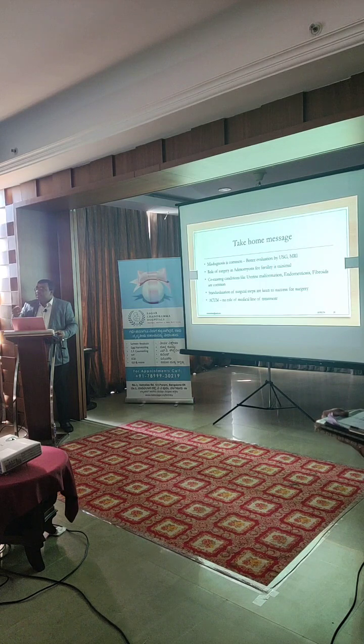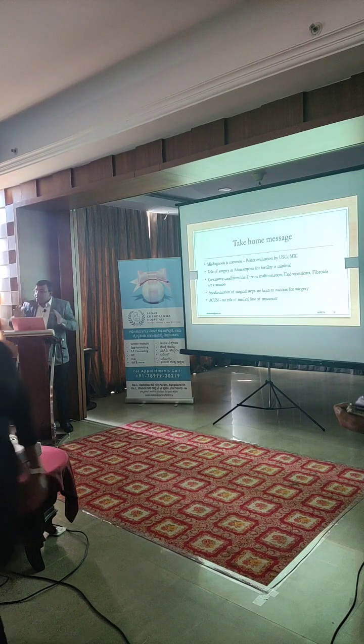I started resecting. Because I was not given the right information, my resection went up to the endometrium. But the thing is, there is no harm even if you open up the endometrium. It's still okay because you know where your boundaries are. Once you know the boundaries, give a half centimeter margin and then start resecting all that is required and then leave the endometrium.